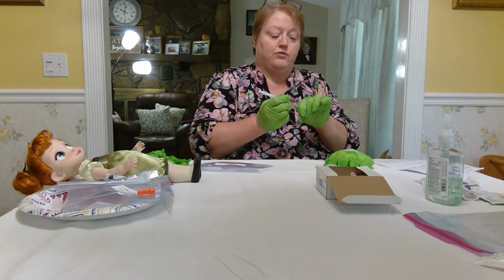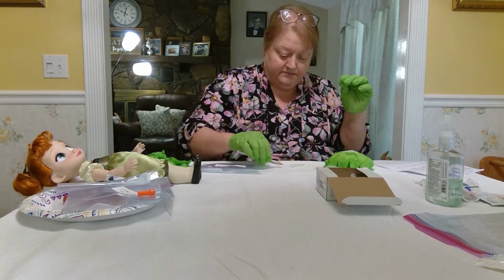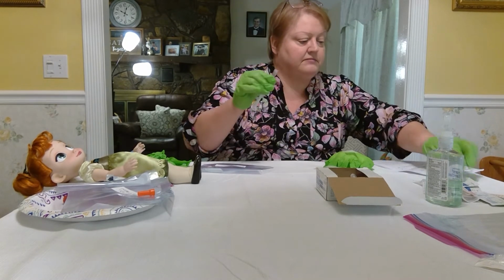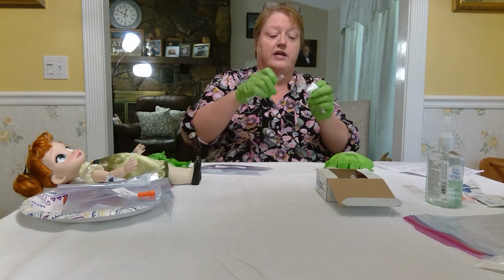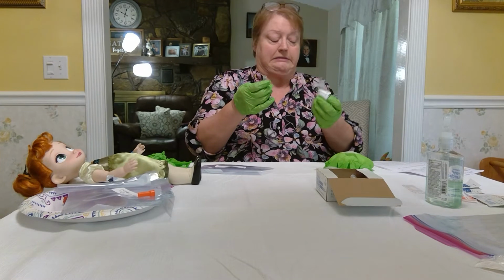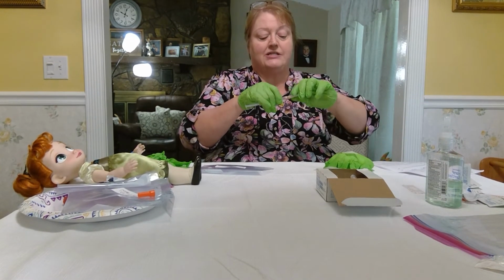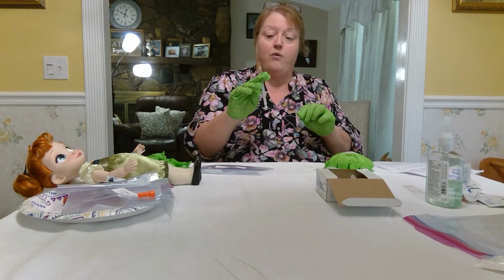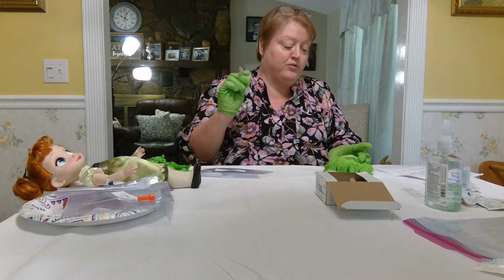I'm going to replace my cap, change needles. If you have an extra needle, you can change it at this point. If you do not, then you will have to use the old one. This is not matching, so I will have to go back to my original needle and just tell you that I will change a needle before I inject. You always use a new needle from what you have drawn your medication up with when you do IM.